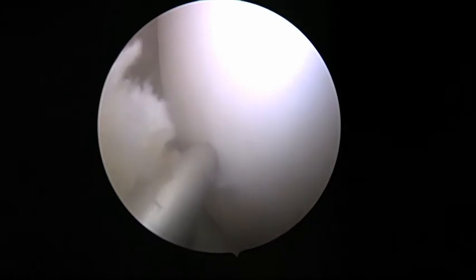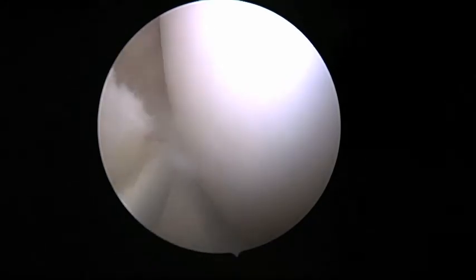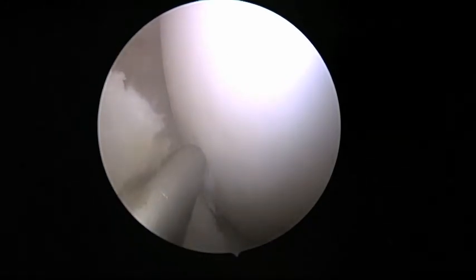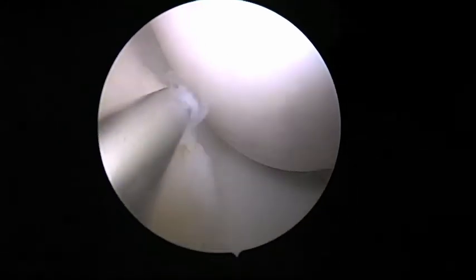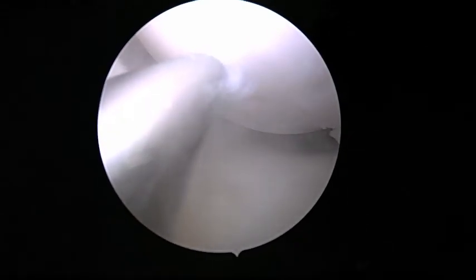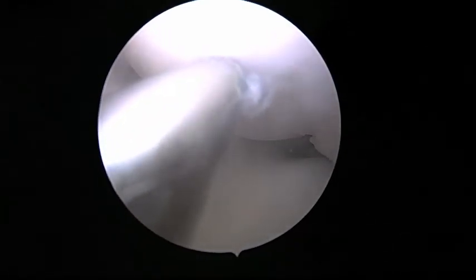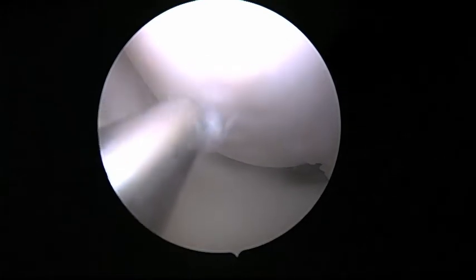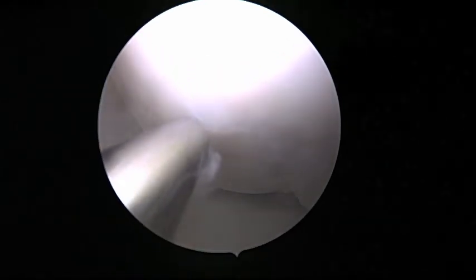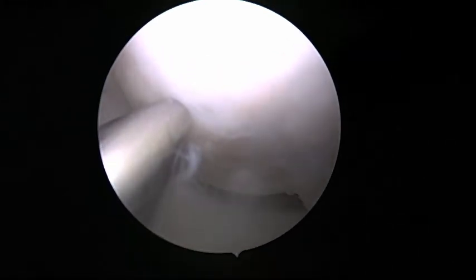As you can see, the blunted tip has left small impressions, or dimples, in the cartilage of the weight-bearing portion of the medial femoral condyle. When this same amount of pressure is applied to areas of cartilage not overlying the lesion, a dimpling effect could not be visualized.